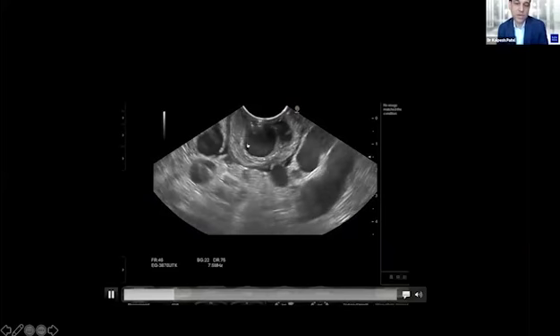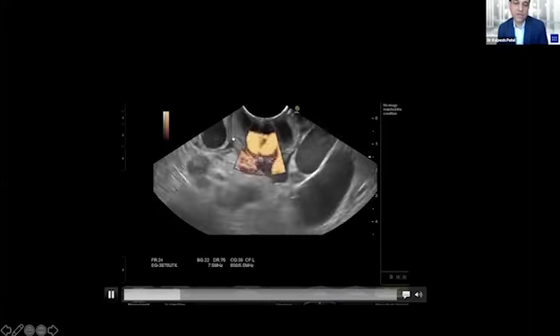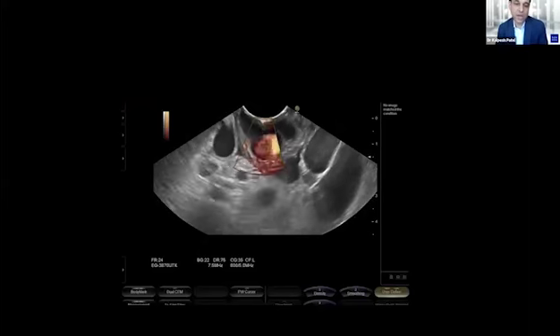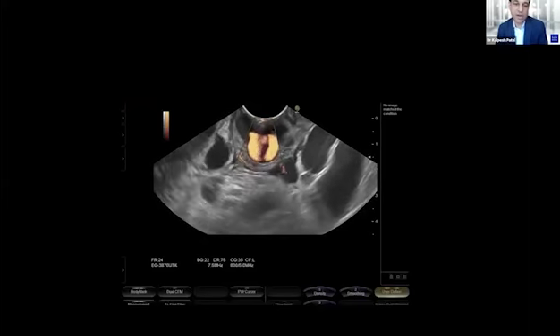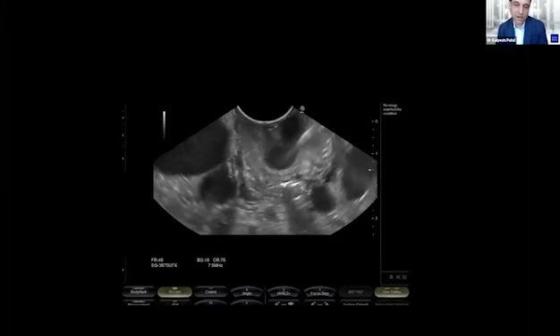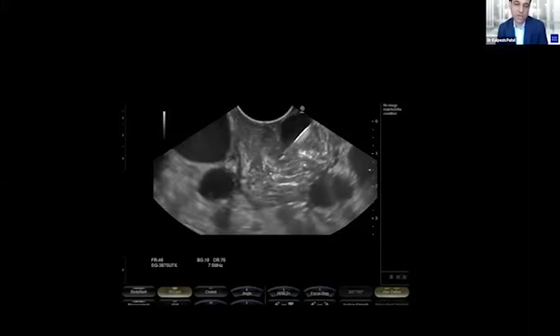Again, very important to note that the varix is within the submucosa of the GI tract, and a similar technique here. Once we identify under Doppler the targeted varix, we're then going to puncture with our needle right here. And it's very smooth, very easy to puncture.